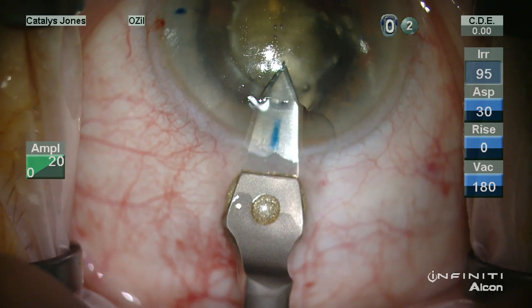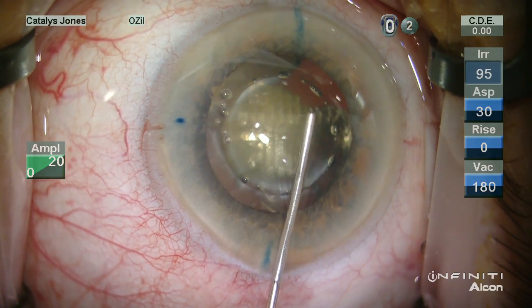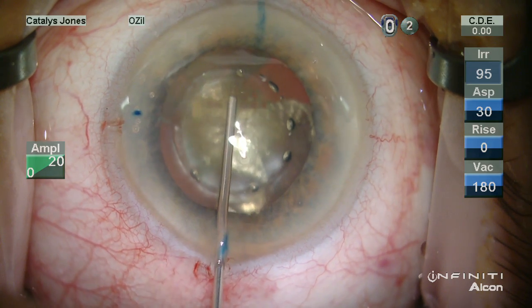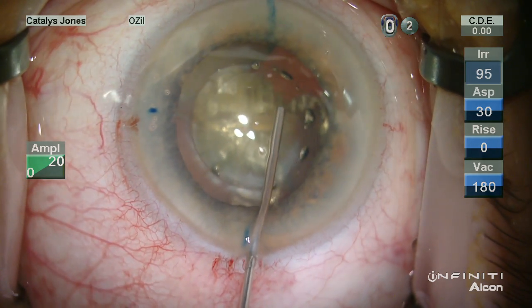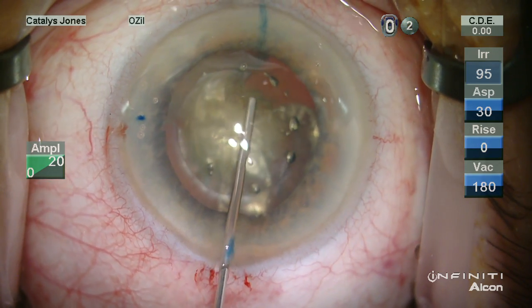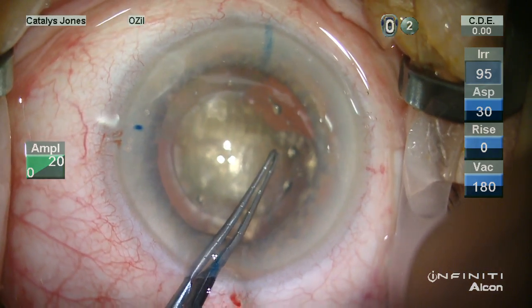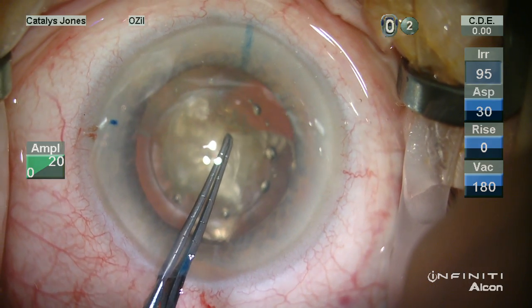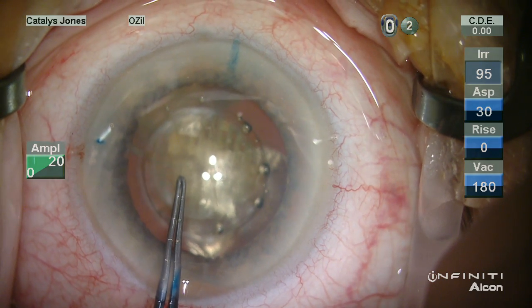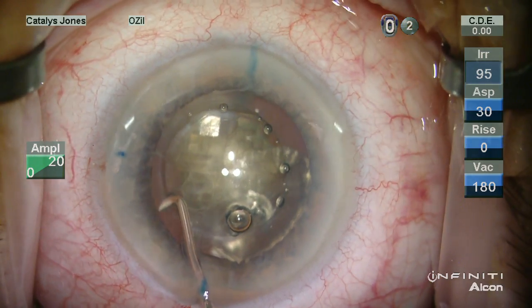Once in the OR, the orientations are marked for the incisions and the lens placement. Viscoelastic is used to expand the anterior chamber. The cannula of the OVD is used to test the capsulotomy, and there are some areas that may still be attached. So using Utrata forceps, this is carefully separated, and we can see that we have complete separation and then removal.